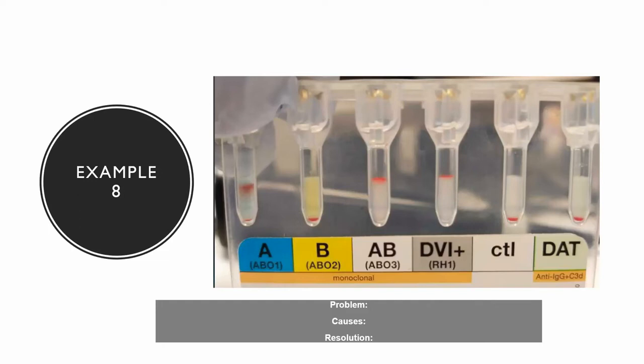So they came in a car accident or something and they gave them a unit of O negative. So mostly A cells of their own, but some O negative cells. Or O positive, because you don't see any negative cells in your D.